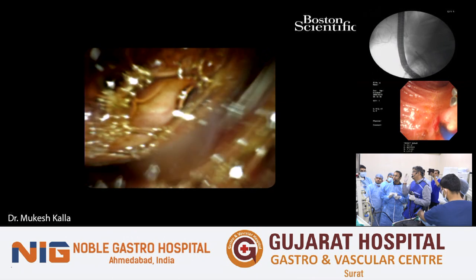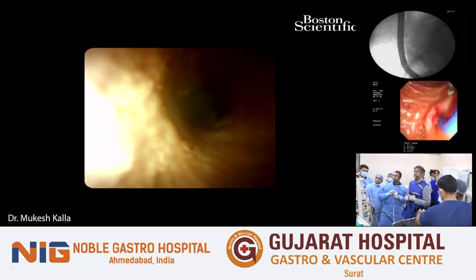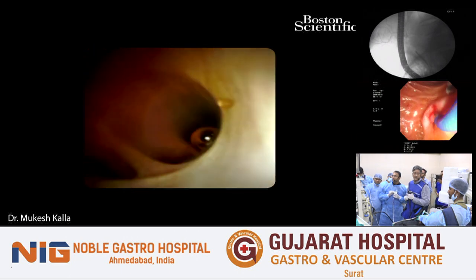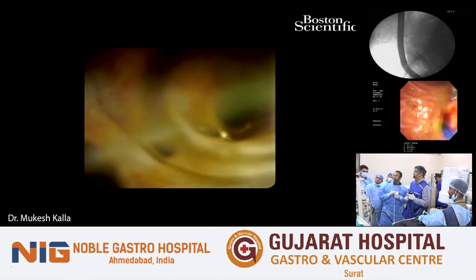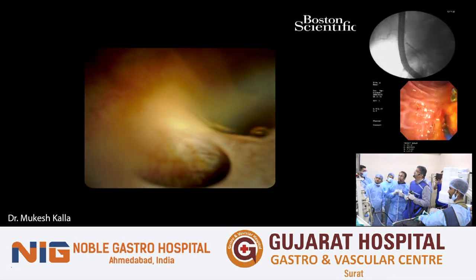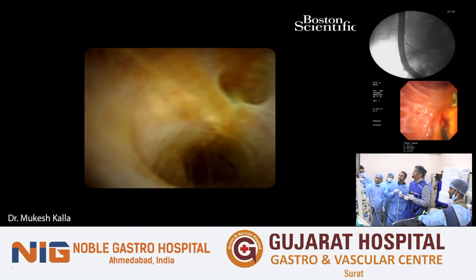Move a little. Now I'll go inside. Yes, okay. Wonderful. Nice. Okay, so yeah. This is the hilum. So this is a beautiful picture of the hilum. So I think things appear good.